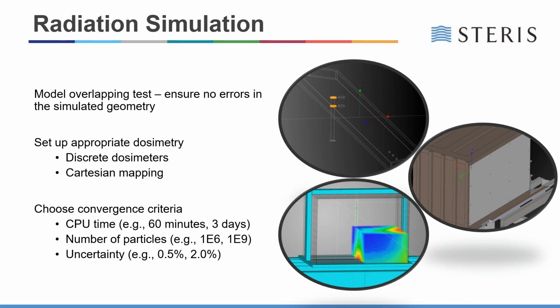And what this looks like is that the model would be checked within the radiation software package. And these checks consist of the areas where the geometries of two different materials may be unexpectedly overlapping, as shown in the first image here on the top. This orange area highlighting the overlap itself.